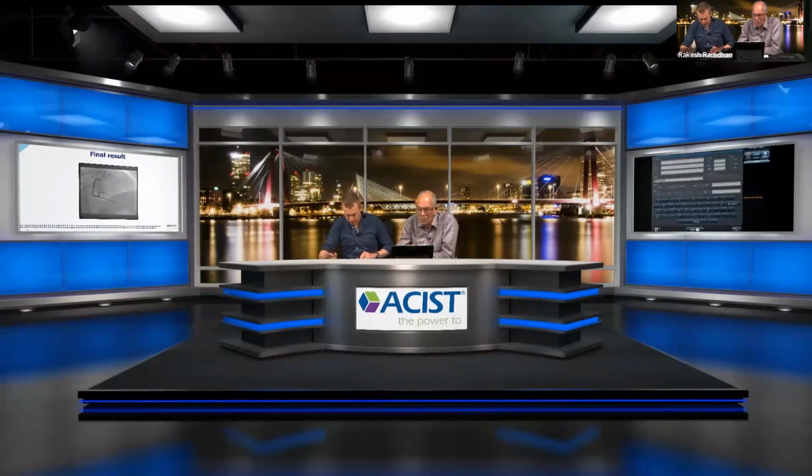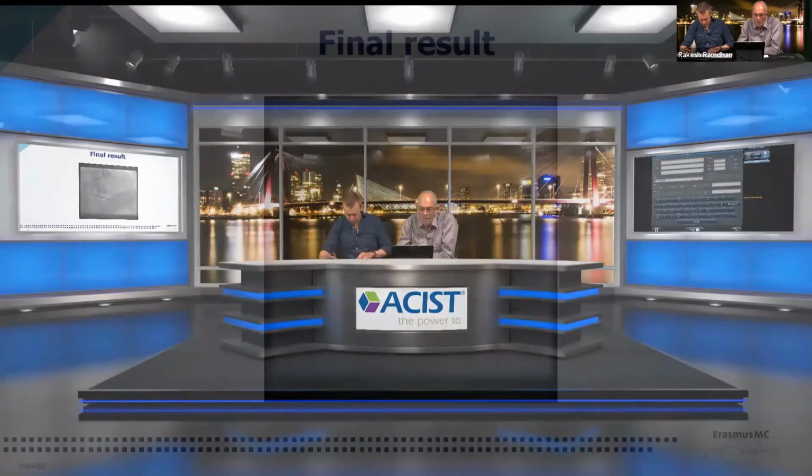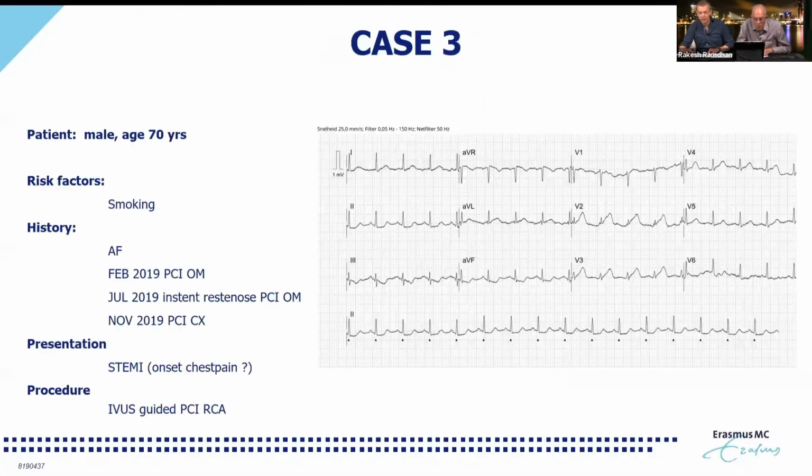Case number 3, if we go back to the slides, is a male patient of 70 years old. Also smoker, but in this case a history of AFib and 3 PCIs of the circumflex and obtuse marginal, who presented now again with a STEMI with ST segment elevation in the anterior leads, ST segment depression inferior.